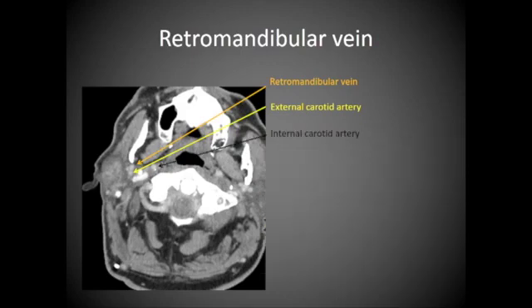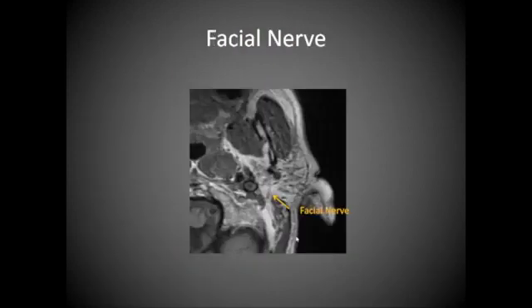In the neighborhood, just deep to that, the internal carotid artery, the internal jugular vein, and actually fairly close in some patients, the vertebral artery, which can actually come into play with some biopsies. I just have to watch for that. The facial nerve, the dreaded thing for our biopsies. We can't usually see it with ultrasound.